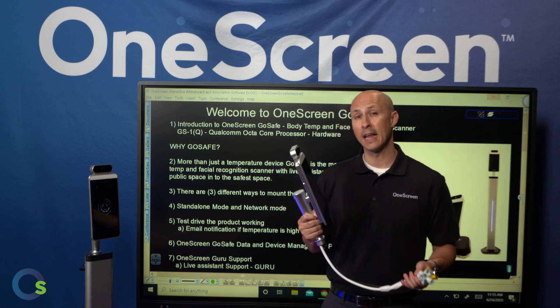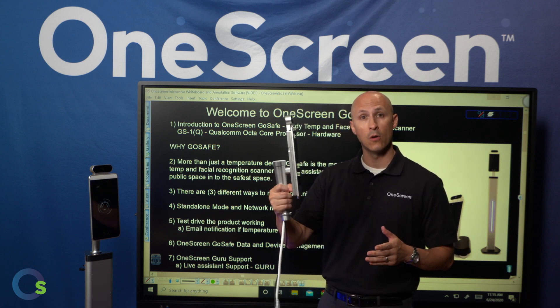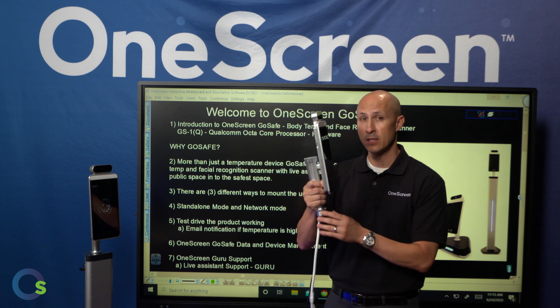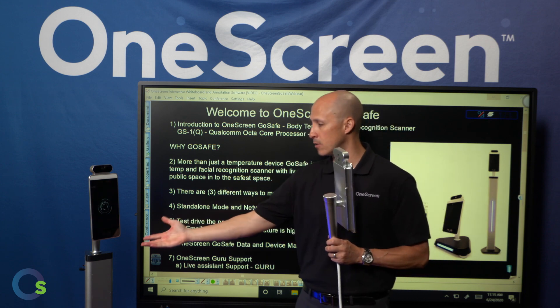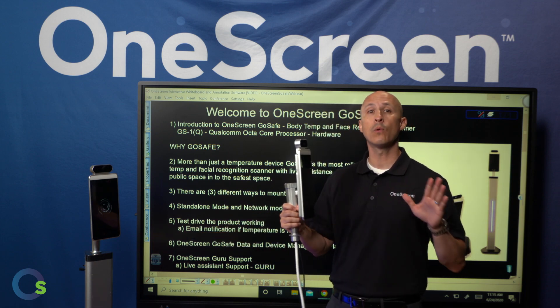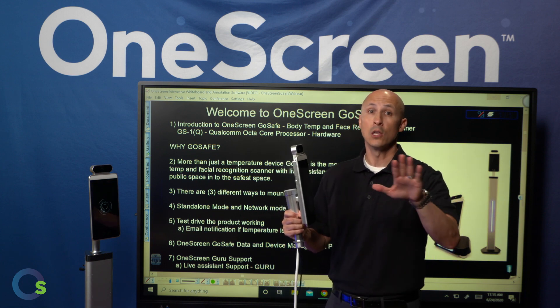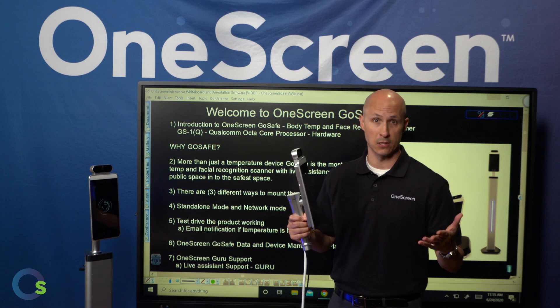Now let's jump into the different ways this can be mounted. We have a wall mount device that can be placed on the wall wherever needed. We also have a table stand that will sit on any platform, and as you can see here to my right, we also have a four-foot tall floor stand. Any one of these options are available to you, and within your own facility you might have a mixture of these mounting options depending on your entryways and exit ways.